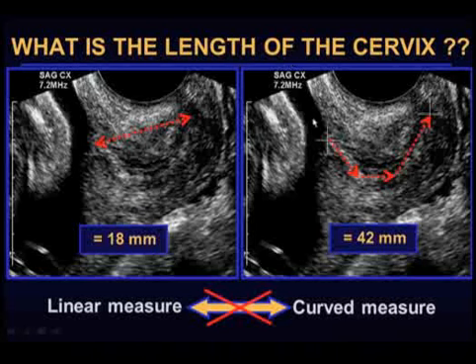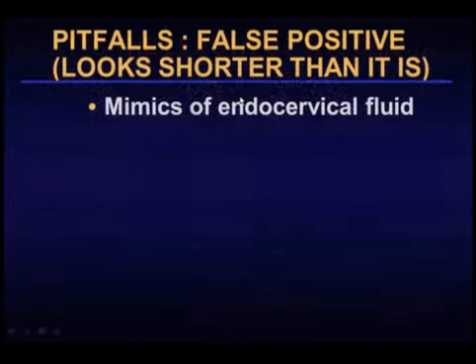I think that this configuration of the curved cervix is not that much of a problem in the 3rd trimester, when the cervix is actually, I think, more linear in most cases, but sometimes in the 2nd trimester. And after all, women who have incompetent cervix, that's the time you might want to be following these women. And just don't be sloppy. Put your calipers on appropriately. Get a good measurement.